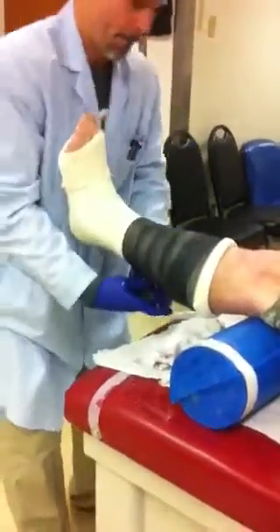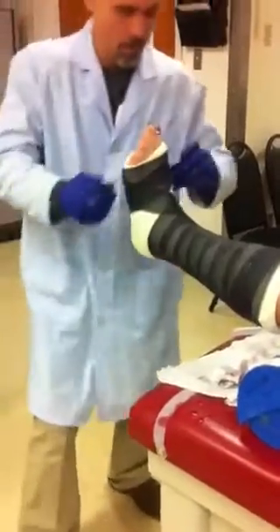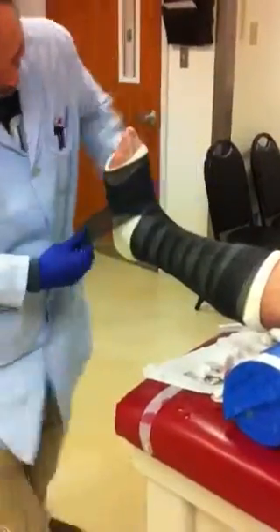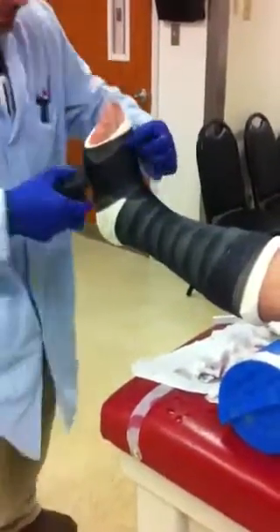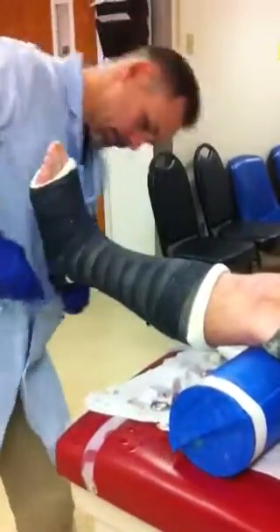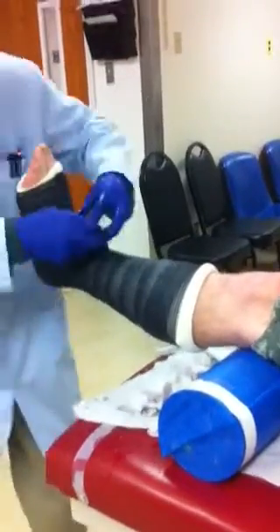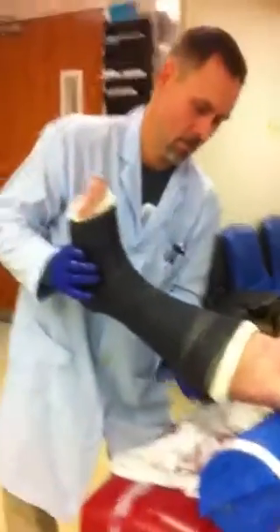The final roll is going to be a black cast — this is the cosmetic roll. It goes best with our uniform. Do they not have camo? We used to, but we don't anymore. We do have pink — would you like pink? No. I look pretty good in a pink dress, and I have had requests from some guys for pink, and I've granted those requests. It would be cool to get a cast for October — awareness month. Right now we're close to Christmas, how about red and green? Red and green would be good. The black shows off my eyes so much better.